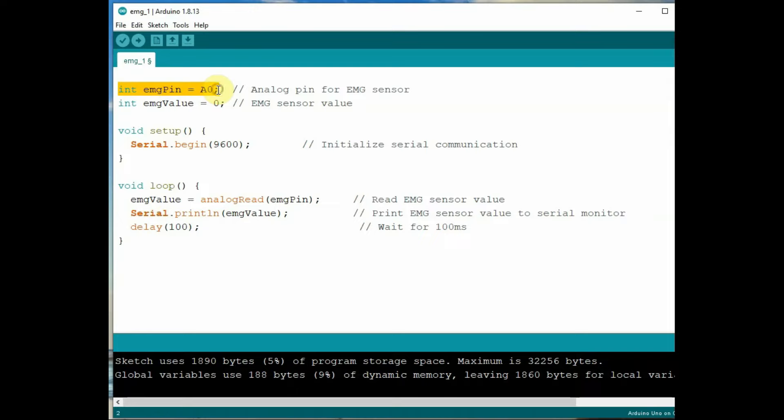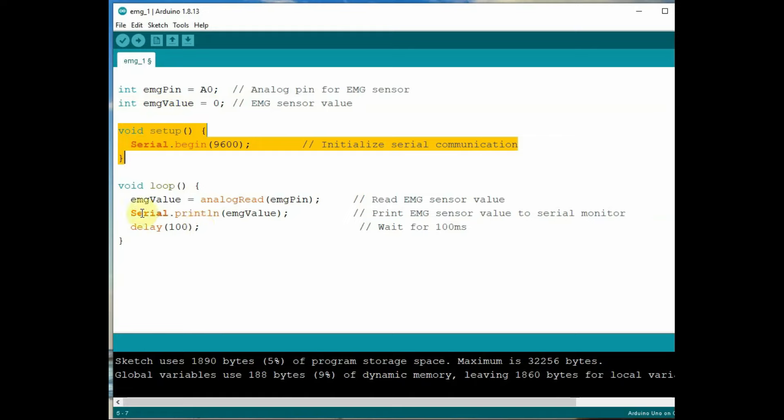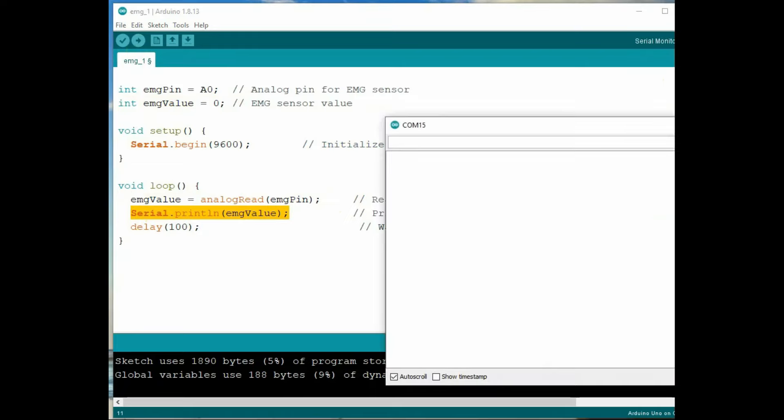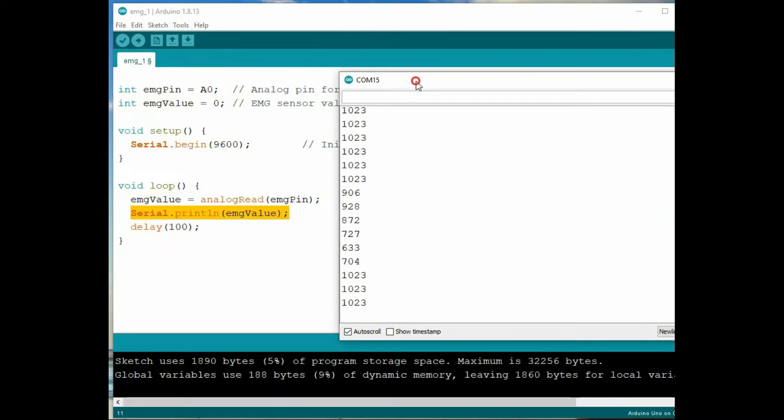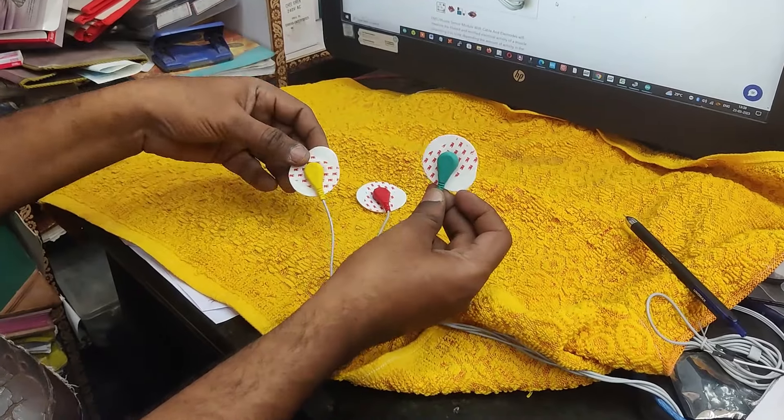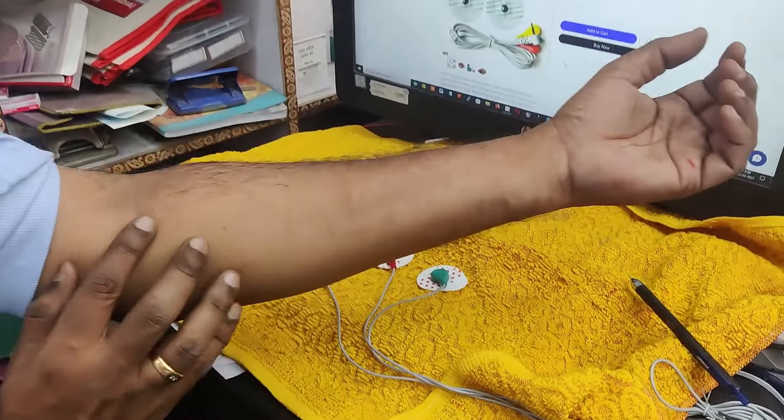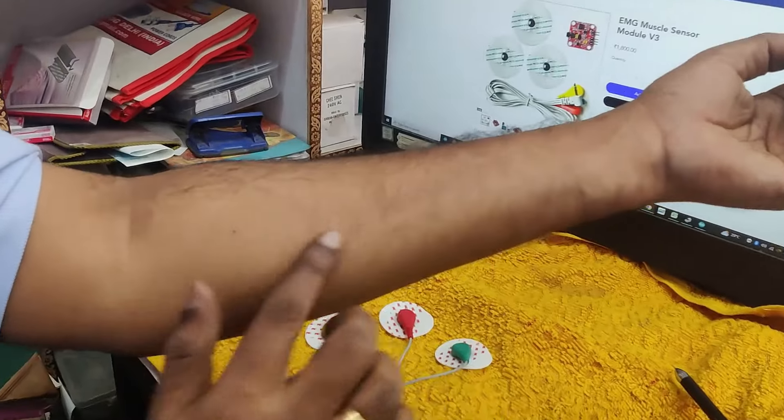Now let us see the Arduino code. This is very simple code. We assign the A0 analog pin to EMG pin and then we use an integer variable to store the analog value. Under void setup we start the serial.begin and under void loop we use the analog read function to read the values and assign it to the EMG value integer. Open the serial monitor. Now we get only the maximum value analog value 1023 as we are not connected the electrodes here yet.